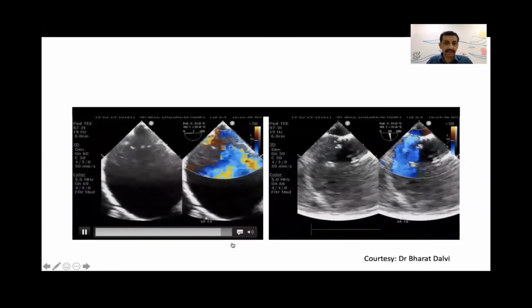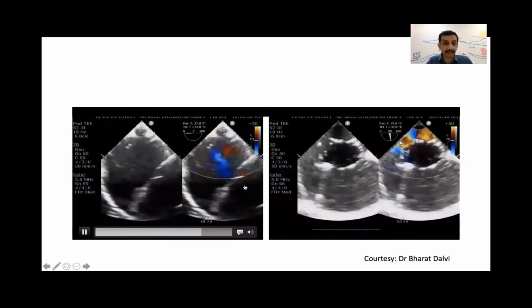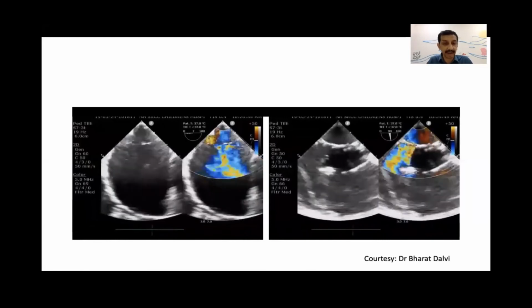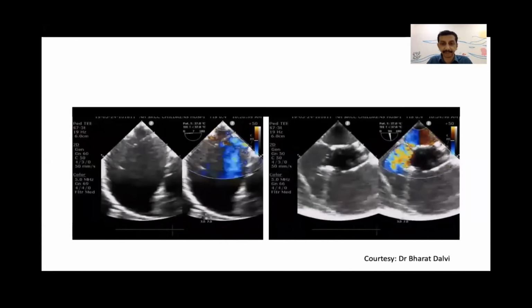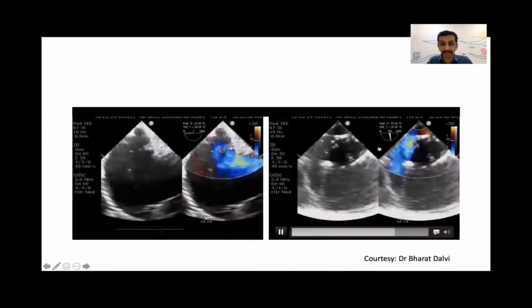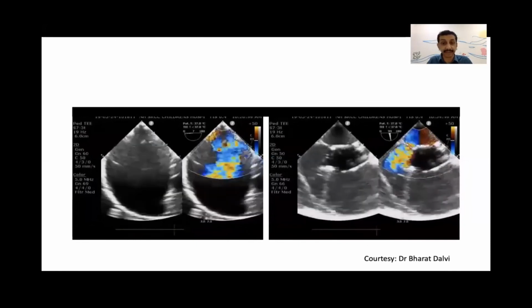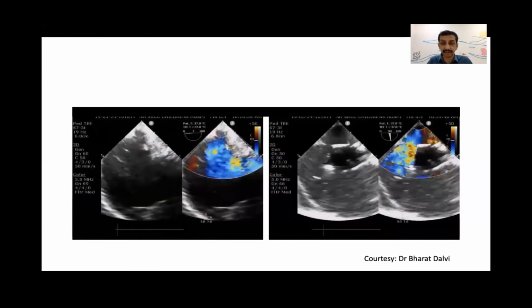This was a slightly more challenging case who had a large central anterosuperior defect, which was measuring 13.5 mm, and multiple additional fenestrations in the posterior-inferior septum. So with the sizing balloon across this anterior superior defect, you can see that we are not able to achieve stop flow, even with overinflation of the balloon. We are seeing that the additional fenestrations are significant.